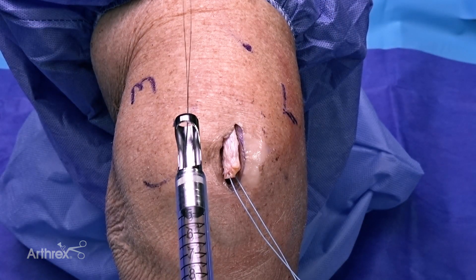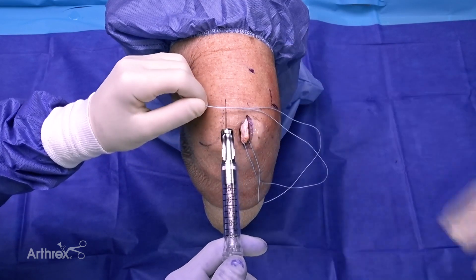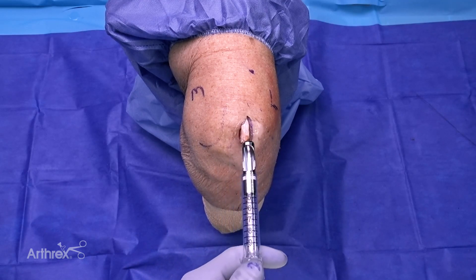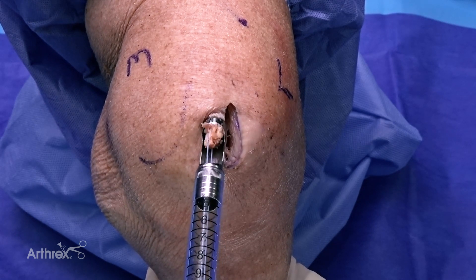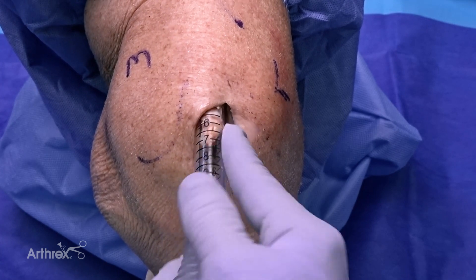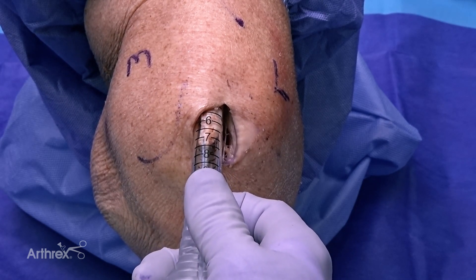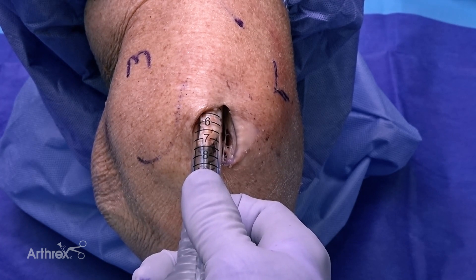We have harvested our nine by 20 millimeter bone plug off the superior pole of the patella in the traditional fashion. To get the sutures through the bone plug up into the graft harvester, we use a suture passing wire. I will now begin harvesting the quadriceps tendon graft using the QuadPro harvester, moving from distal to proximal. Large rotational movements will facilitate cutting the quad tendon as we release it proximally. We have maximized tendon length here at approximately 75 millimeters. Once I correlate graft length with the proposed length based on the patient's height, I will amputate the graft to complete the harvest.